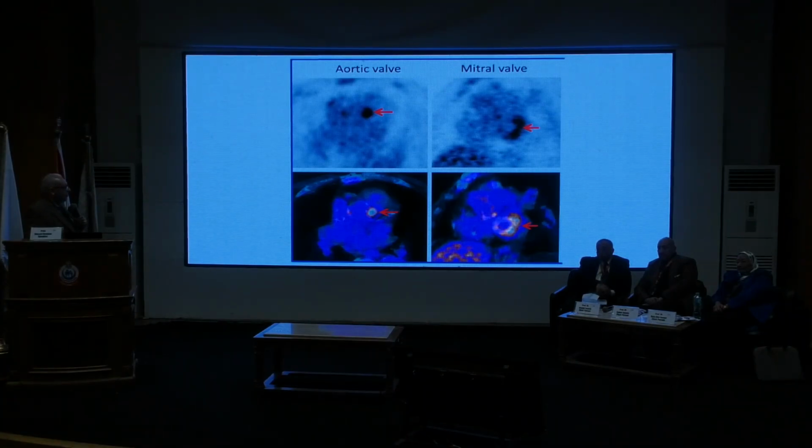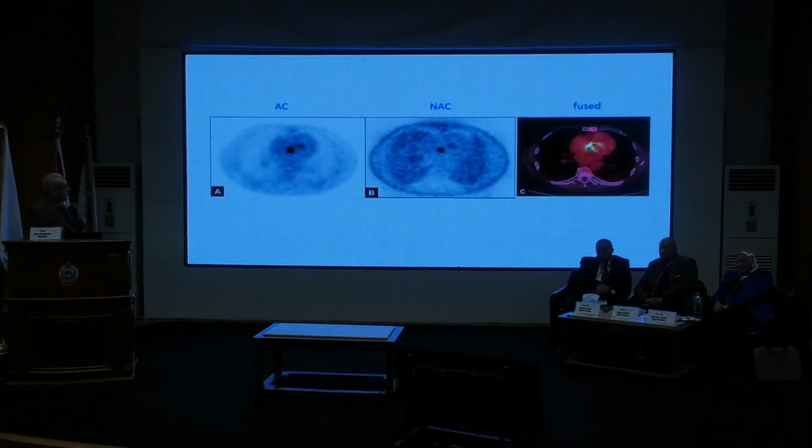Another positive case, two positive cases, one for aortic valve, one for mitral valve, focal uptake, and here is multifocal heterogeneous uptake. Another case, AC positive, non-AC positive, and in the fused image it is seen localized over the valve.